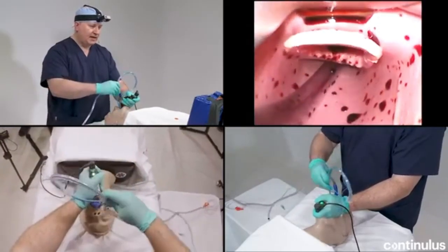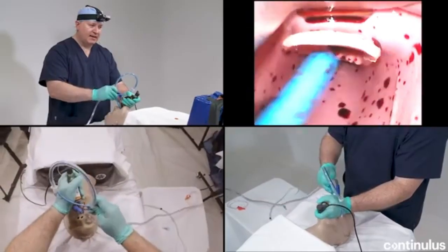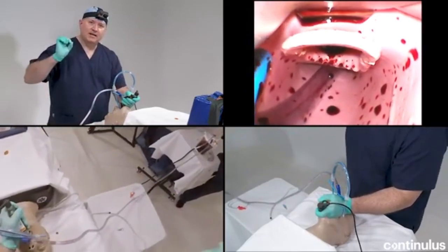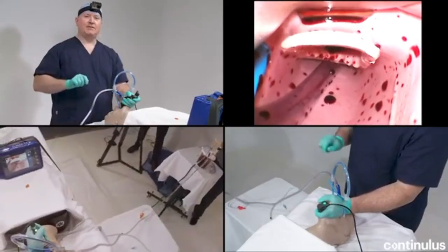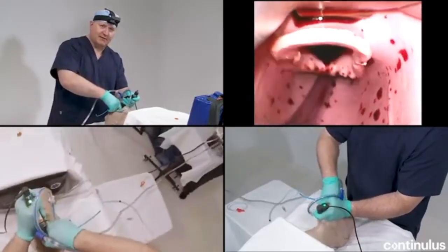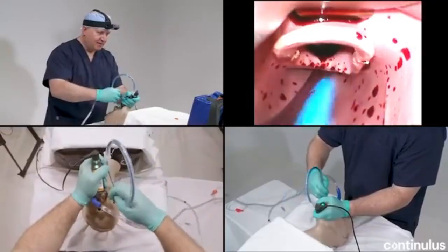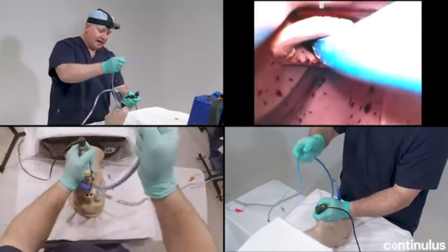As you can see, if I limit my space for tracheal tube delivery, what actually can happen is I can see what I want and I can't get it. That is like the biggest complaint with using video laryngoscopy. You can see it, but you can't have it. Why don't you do what we do in America? We have it all. We stick our finger in, and we get what we want. Now I'm going to release the tail, and now I'm going to advance the tube.